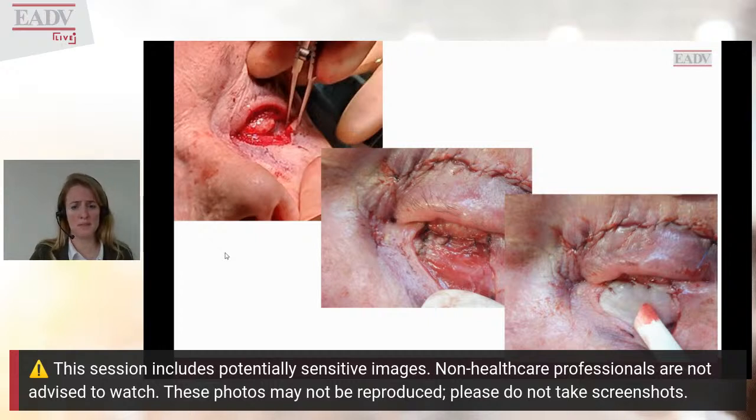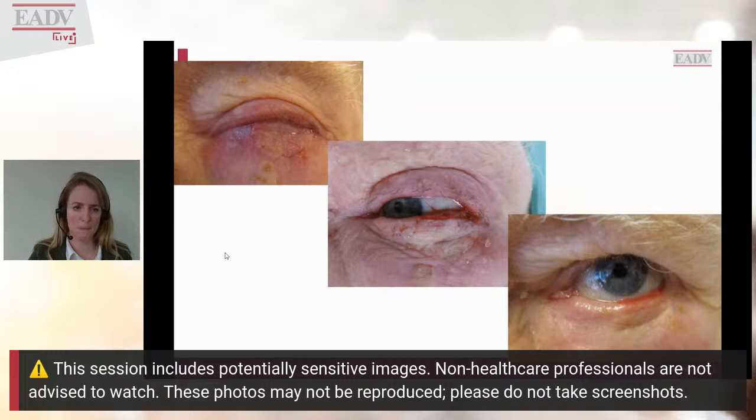If these sutures are all in position, then I suture in my graft. There are 2 important sutures also to position there. These are the most superficial sutures, where I attach the graft very superficially to the tarsoconjunctival flap. But it's important to not perforate it, of course, because in that case you can get corneal erosion.